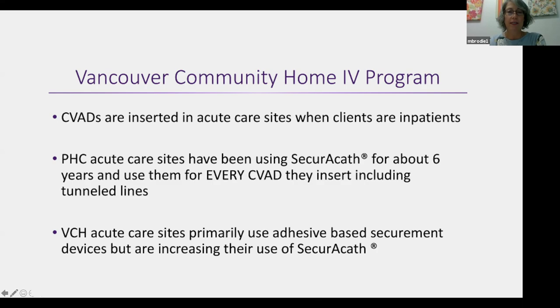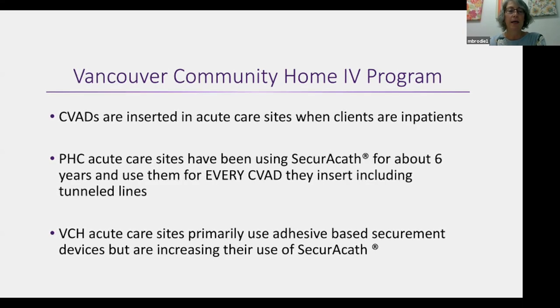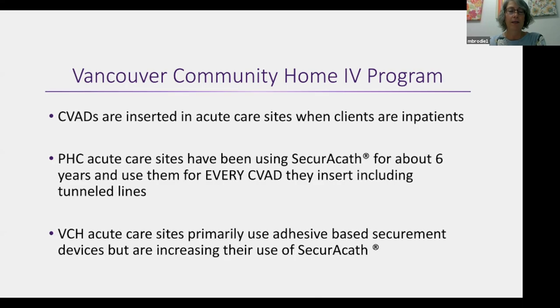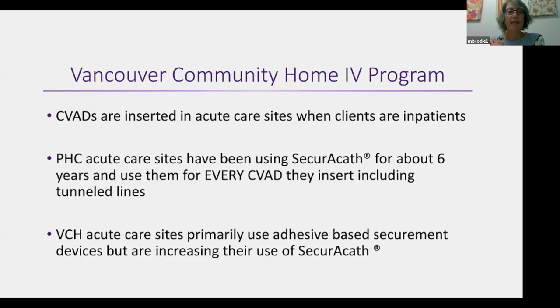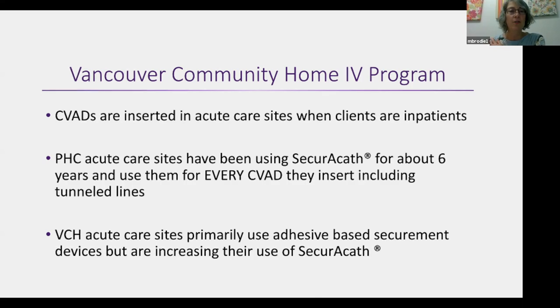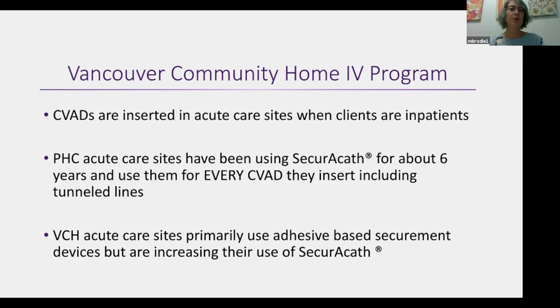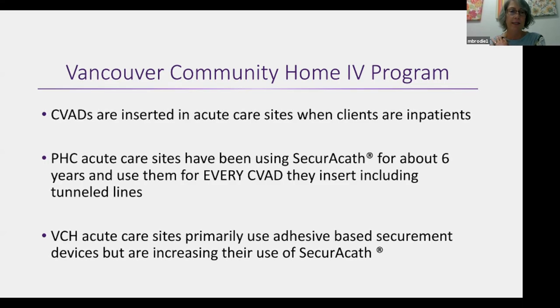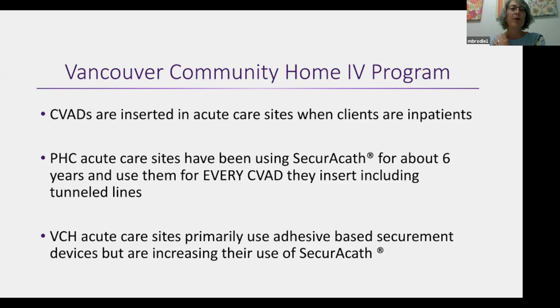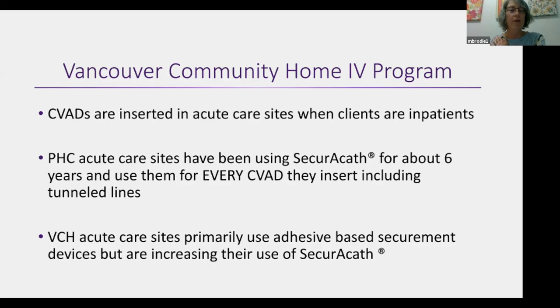All the central lines that we see in community are inserted in acute care. We don't have any community settings where we insert central lines. We primarily see PICC lines and tunneled lines for our home IV clients that are getting antibiotics. Providence Healthcare has been using SecurAcath for about 6 years, and they use them on every central line that's inserted. Everything from PICC lines and tunneled lines to non-tunneled central lines that they see in the critical care and acute care settings. We don't see those in community, but they put SecurAcaths in on every client. And Vancouver Coastal Health also has acute care sites.